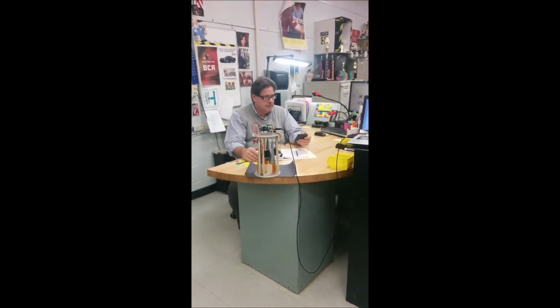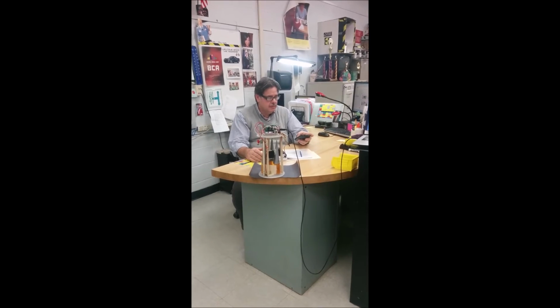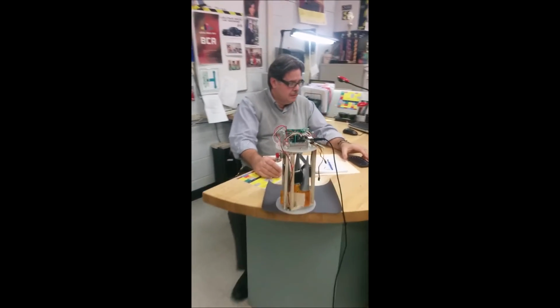The user approaches the device and sees a message on the screen to flip the device. After flipping the device, all pills fall into the cone, but only one gets stuck. Then, the electronic display again tells the user to flip the device back to its upright position.